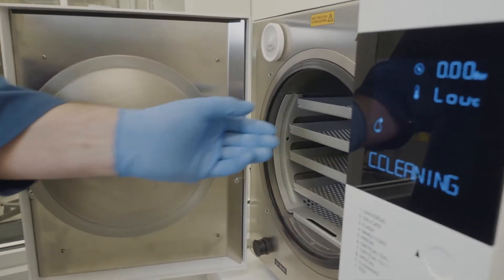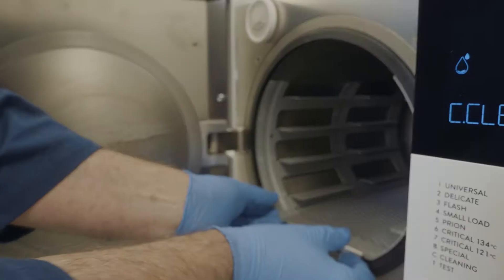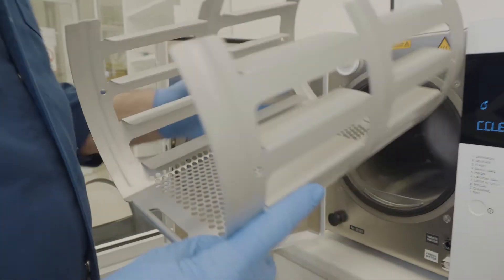First step is to take out all the trays from the machine. Next, take out the tray rack. Lift it at the front slightly and slide it towards you.